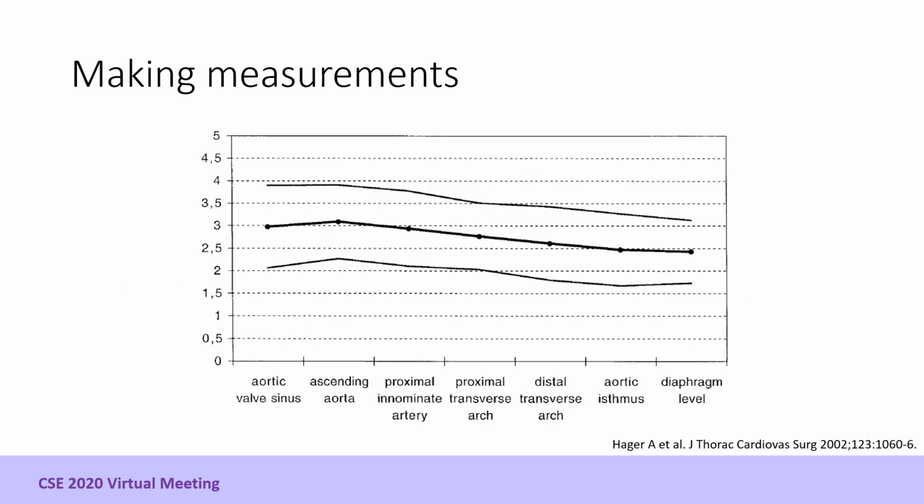While the aortic root has clear landmarks for measurements, the ascending and descending thoracic aorta do not. We know that the aorta gradually tapers as we move more distally, and so in order to make comparative measurements of a structure over time, it is important to specify the location of measurements by referencing them to a given landmark if possible. For the ascending aorta, this may be the distance from the sinotubular junction to the measurement, and for the descending aorta on TEE, this may be the distance that the probe is inserted from the teeth.